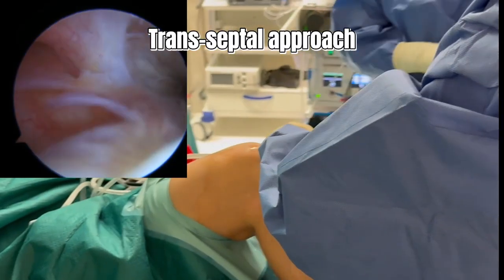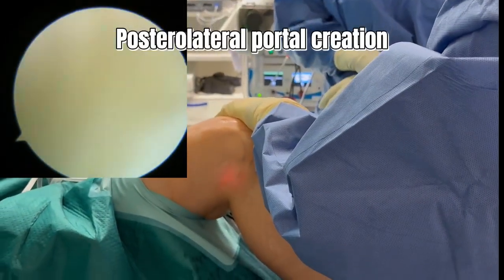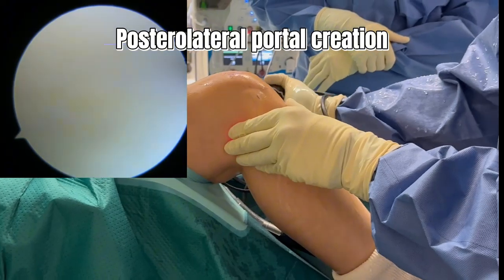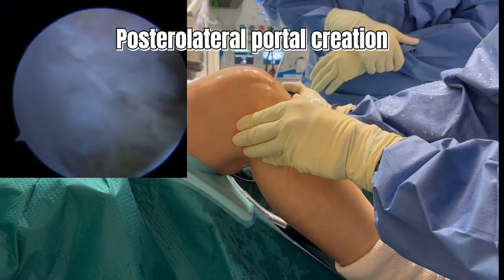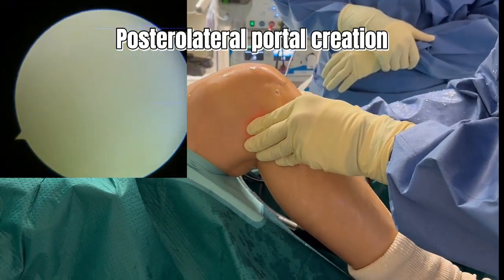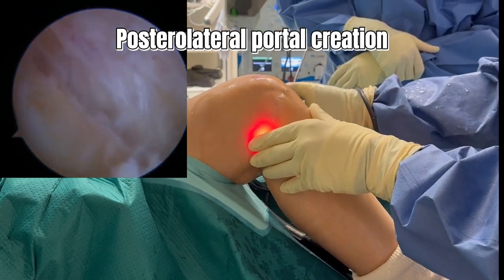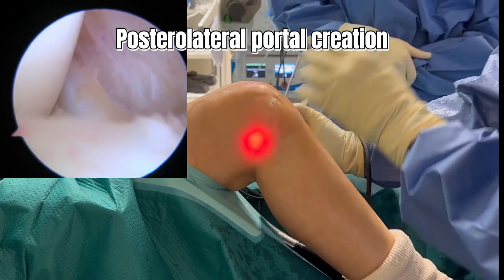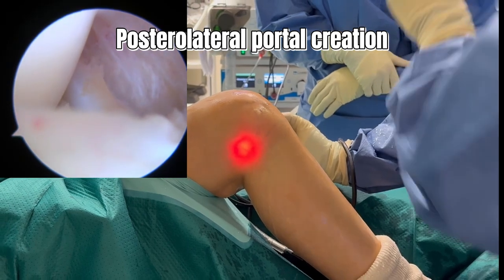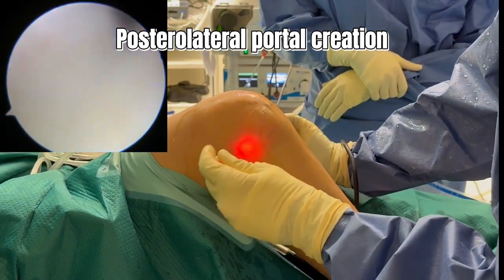The arthroscope is then introduced through the posteromedial portal and advanced through the septum. Under direct arthroscopic visualization and using transillumination with spinal needle guidance, the posterolateral portal is placed posterior to the lateral collateral ligament and the popliteus tendon at the joint line.